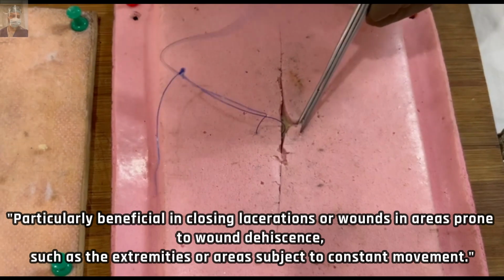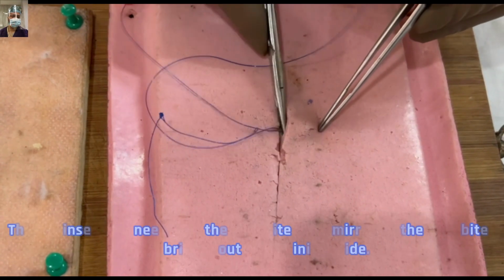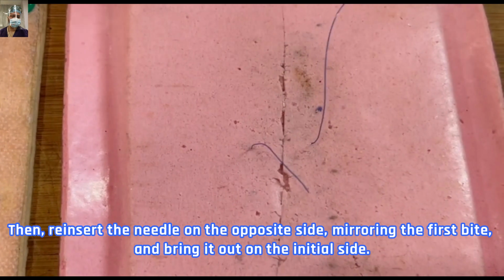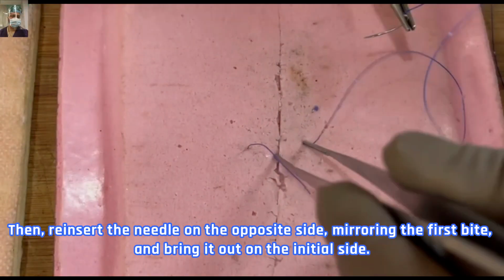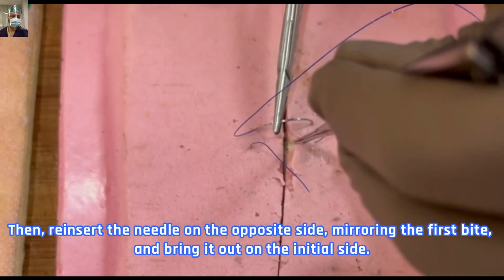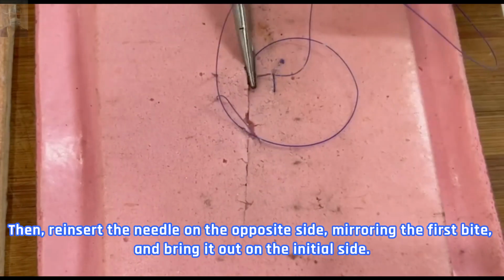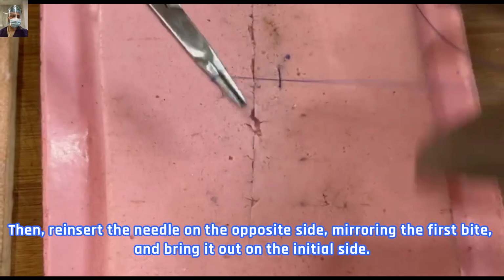So I take another, progressing horizontally and taking a similar suture ahead, and similarly I have progressed along the wound, and now I am opposing. So the suture is away from the wound margin, and it is said to be cosmetically better, and practically, as I said, we use it for the hemostatic effect.